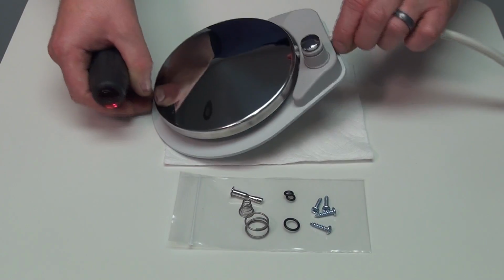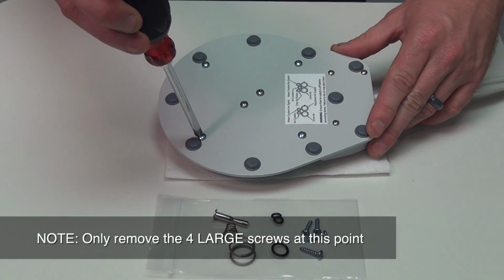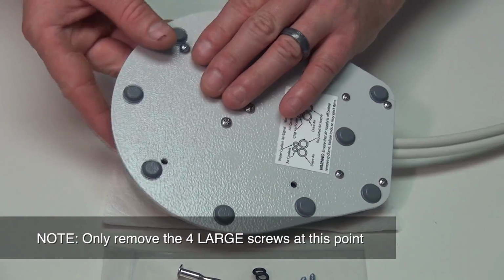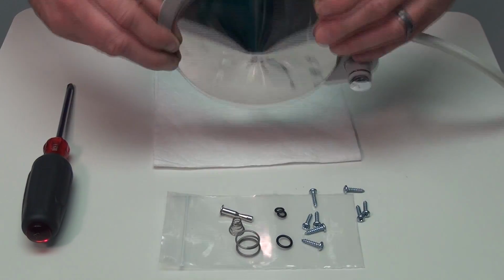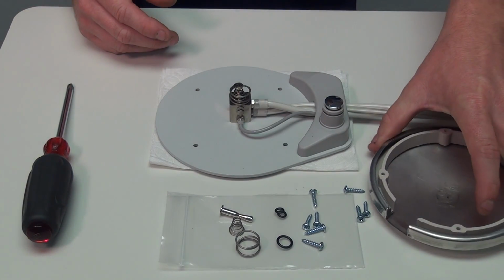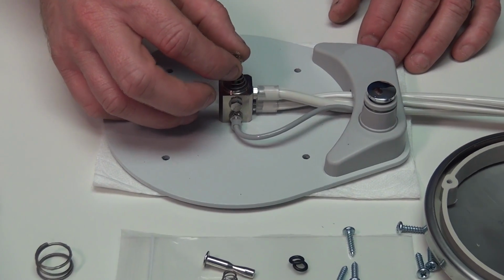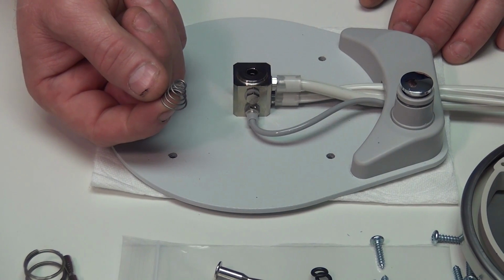Then flip the foot control upside down and remove the 4 larger Phillips screws. Once the screws are removed, flip the foot control back upright, pull off the metal plate. You're going to remove the large spring. Next, you're going to pull out the piston, followed by the smaller cone spring.